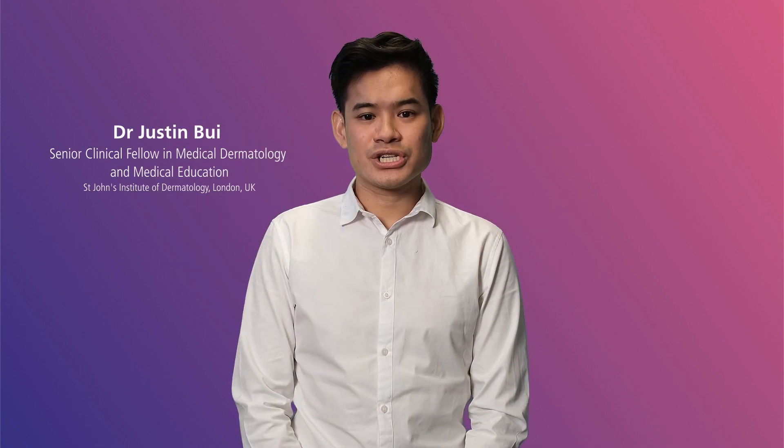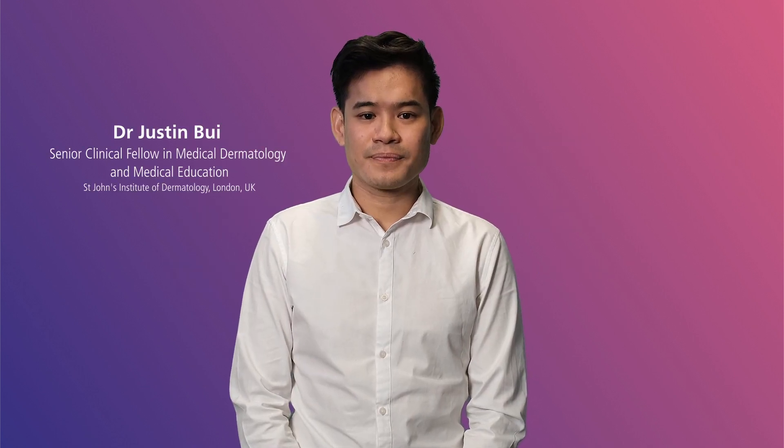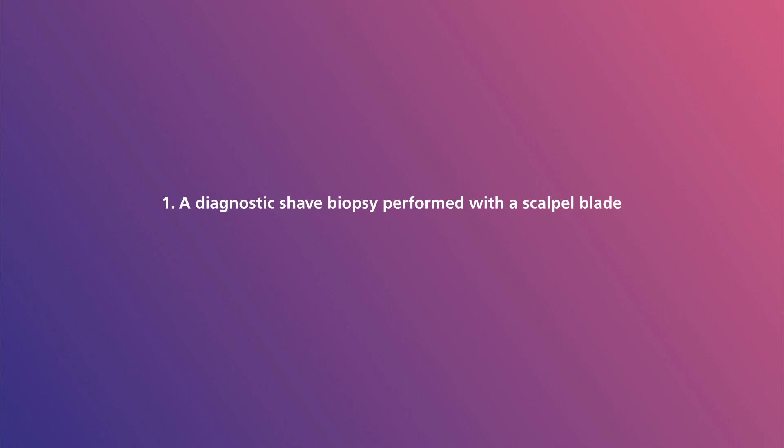Hello and welcome to the shave biopsy procedure video. In this video there are two different shave biopsy techniques demonstrated. The first is a diagnostic shave biopsy performed with a scalpel blade. The second is a diagnostic shave biopsy performed with a derma blade.